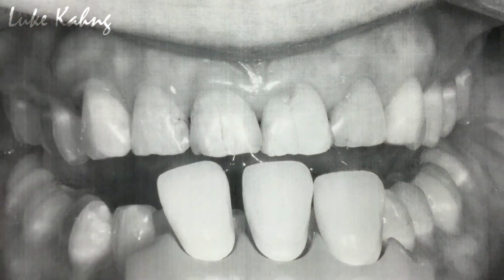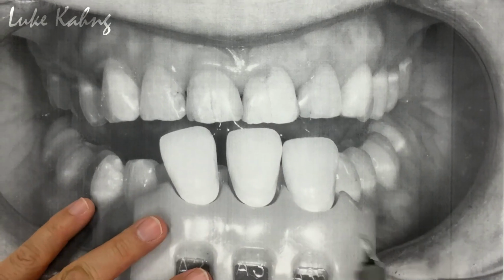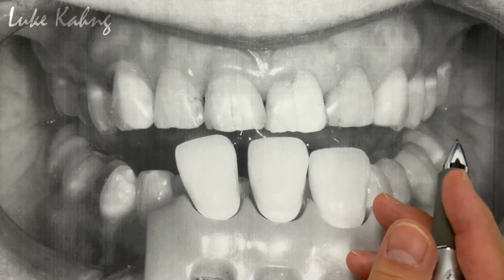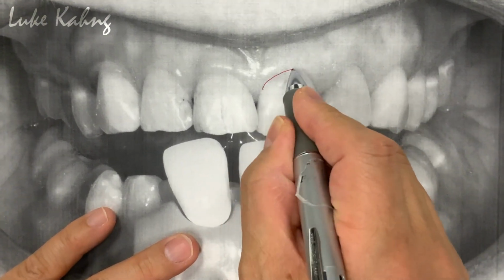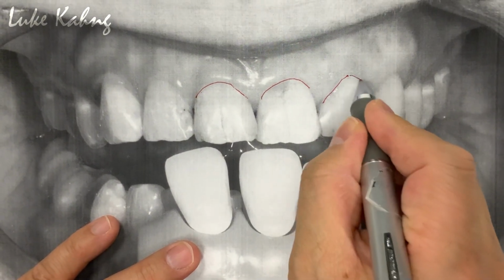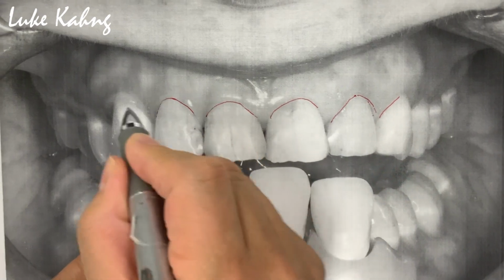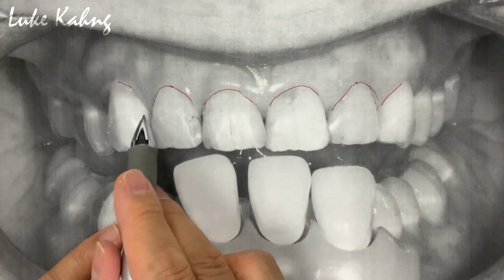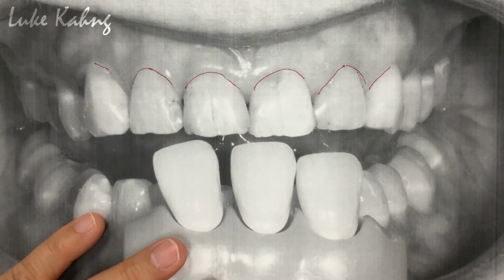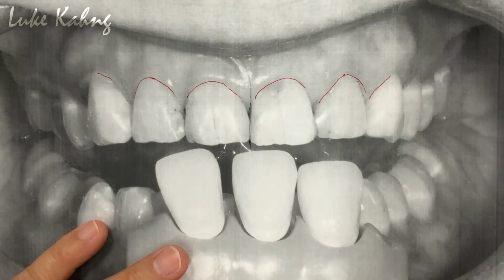What I'm trying to say to you guys, this is the initial photo, which is from the doctor. So we just evaluated the treatment plan wax up. Sometimes the doctor can do the tissue gingivectomy, or some people cannot do. That one is a little bit of a limitation to our final cosmetic. If the doctor can do the tissue management, that'd be awesome. That's perfect.